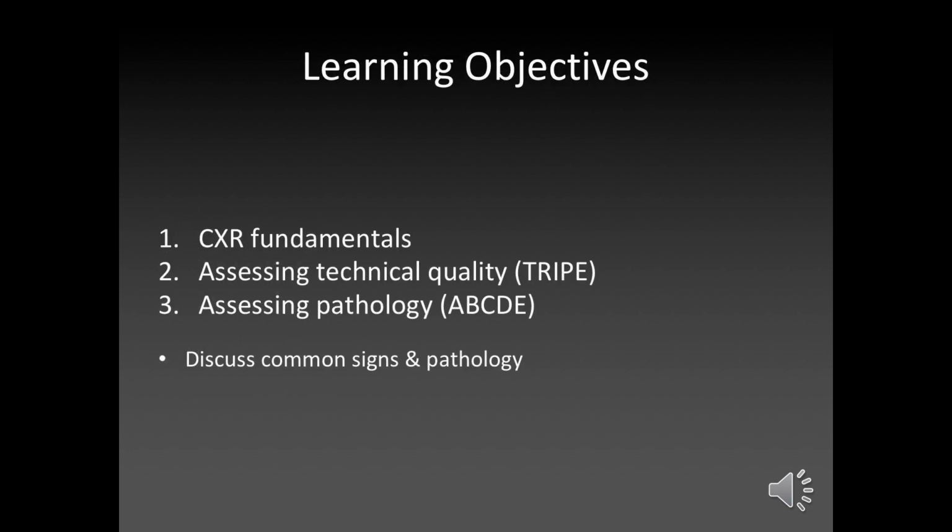So hopefully this session has told you a bit about how chest X-rays are done, and I think that's all the knowledge you need. Essentially, you stick a patient in front of a source of radiation and you put a detector behind them, and sometimes you turn them around to do it, sometimes you lie them down and slide the detector underneath, and then put the source from above.